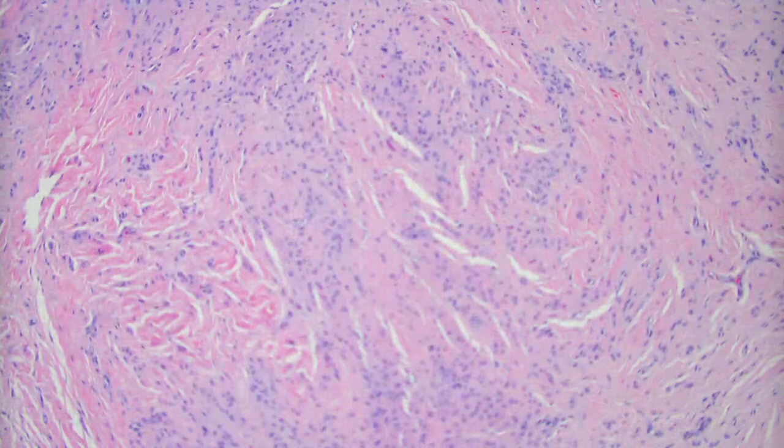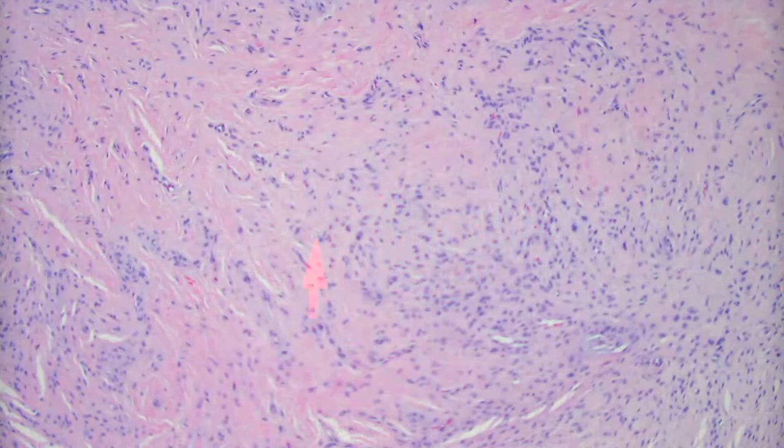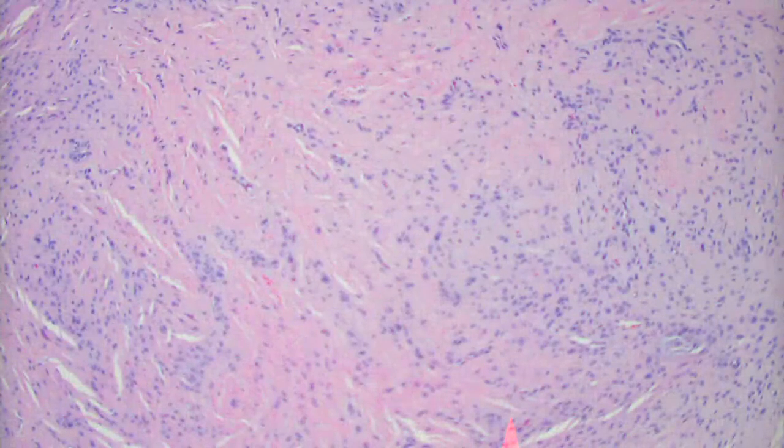Like fibrokeratoma maybe. Yeah, that's a possibility. Again, what's not so good for that? It doesn't have the collarette scale. Fibrokeratoma should have kind of an endo-exophytic look, I think. Well, there's one main reason: it doesn't have all the cells. So you get all these little round cells here, some forming little whorls around some of the pre-existing blood vessels, possibly or a little nerve. That you don't see in acquired digital fibrokeratoma.